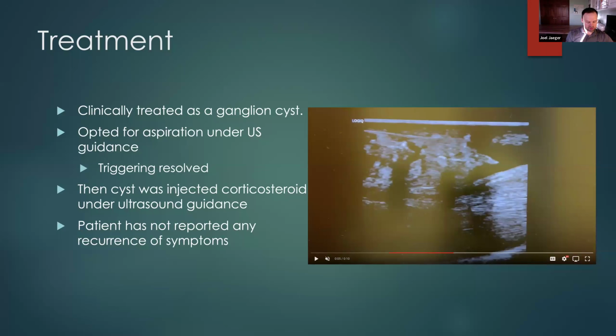But the point of all these videos, to improve our ultrasound protocols, is to make sure that we're not missing these things, and we don't want to be the person who does miss them. I'm using this to demonstrate that the order and method behind doing these things is probably the most important piece. Staying consistent and rigid with those, always scanning a little bit wider view, and hitting all of your check marks can't be understated.